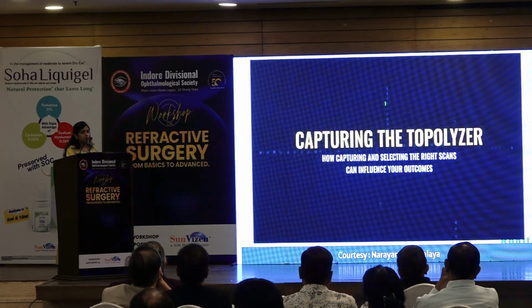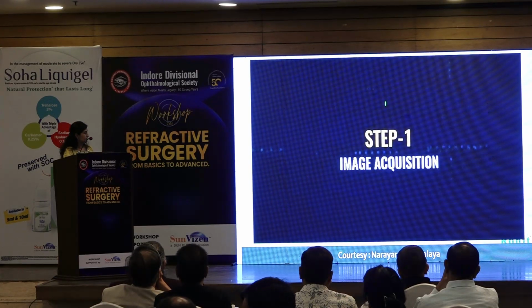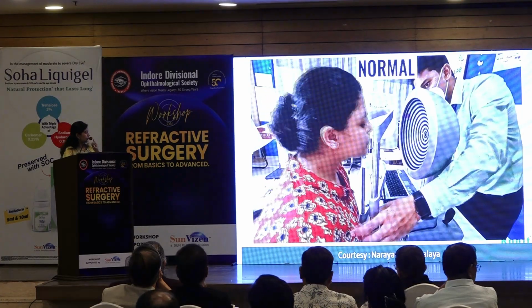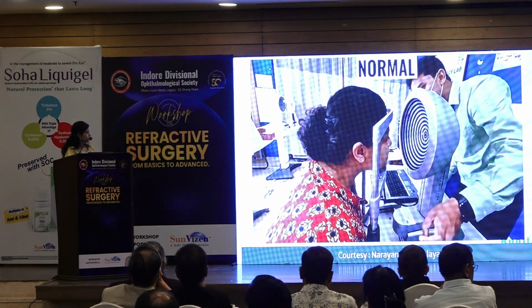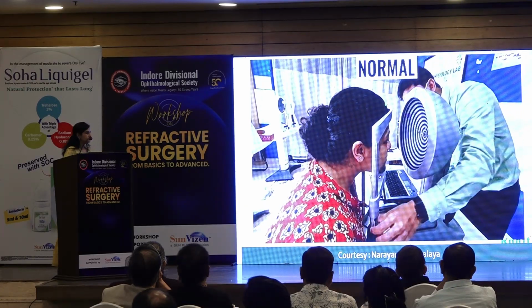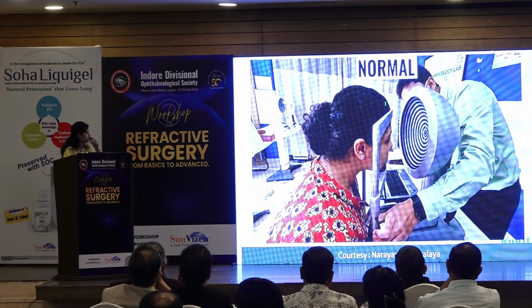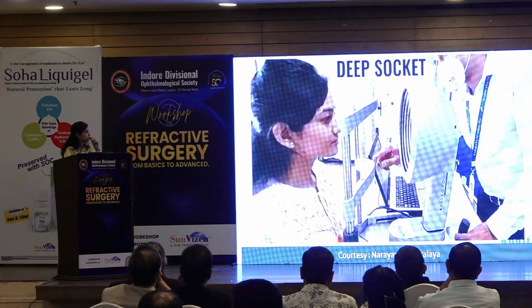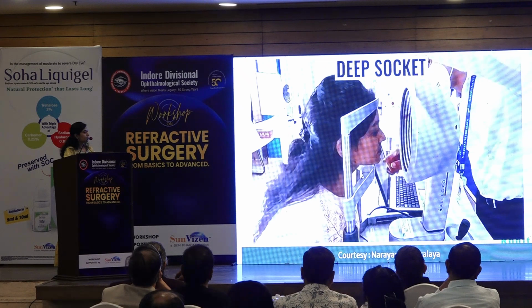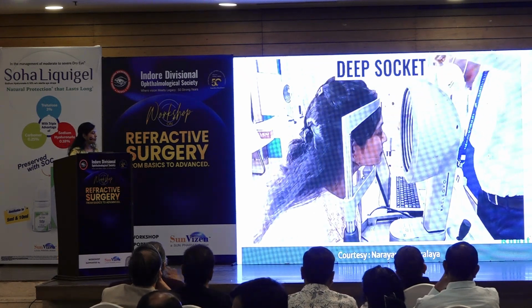Here is a short video courtesy. In order to generate good outcomes in Contoura surgery, it is important to begin with the acquisition of good scans. How do we ensure this? Make sure the patient is sitting in an upright and comfortable position. Have the patient place his or her chin into the chin rest and have his or her forehead properly positioned in the headrest. In case of a deep socket, the patient is requested to place their chin over the railing.